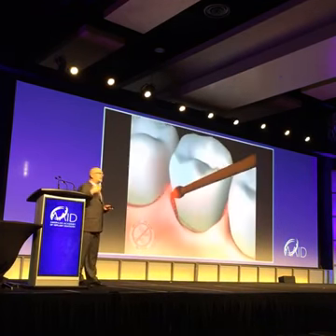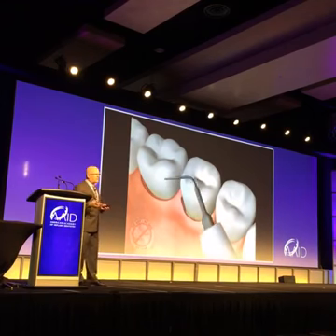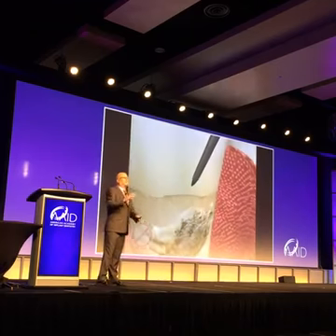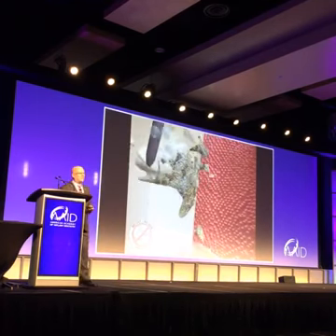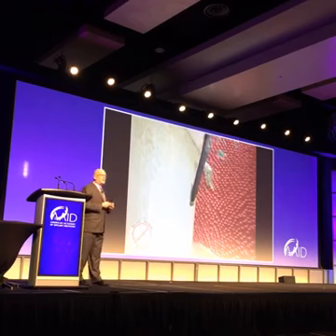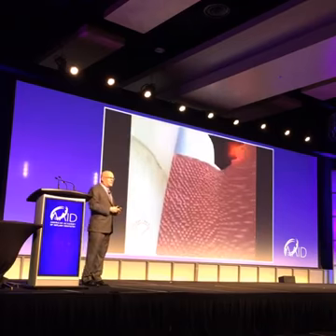Then we go in and we scale and root plane. We use piezo scalers. I have not used a curette for scaling and root planing in over 10 years, and I know this is going to blow some minds. I don't use curettes anymore, but I use piezo scalers to remove the calculus. We have to remove all the calculus. Yes, you have to remove as much as you can. So we remove the calculus.